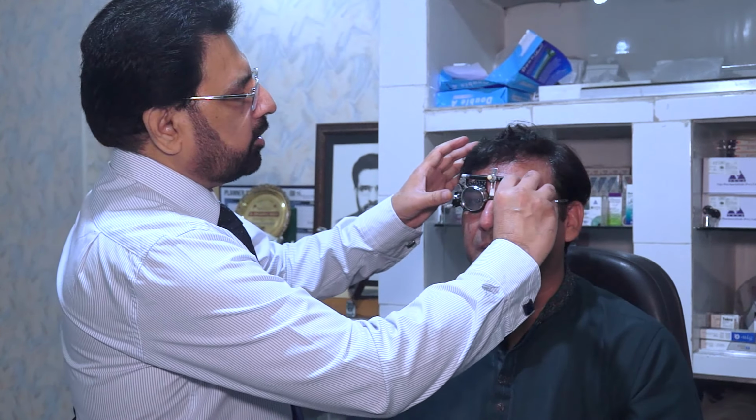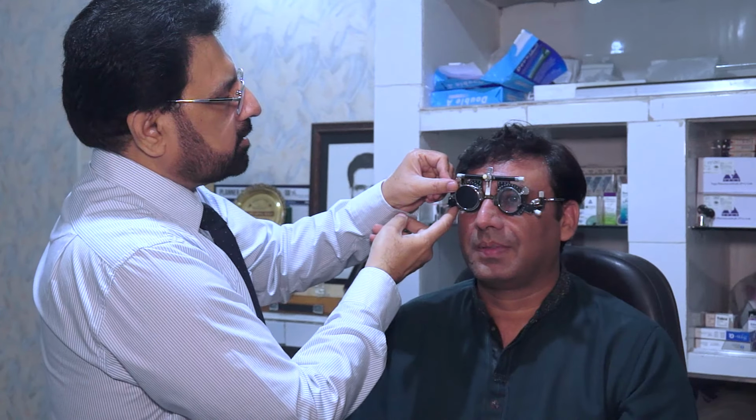OHPNF. Is this one better or this one? This one I think better. Okay, so this is the final refraction of the right eye. Now we are going to go for refraction of the left eye. The same procedure as in the right eye.